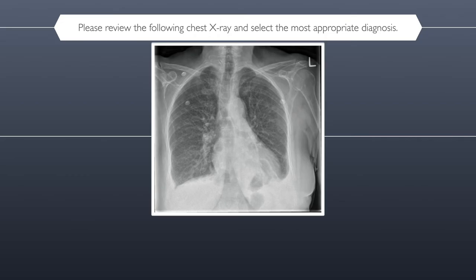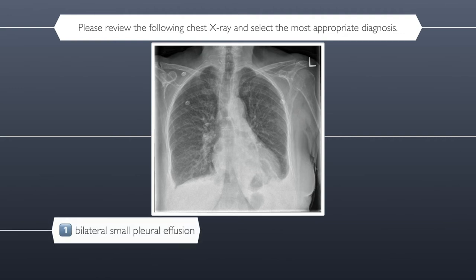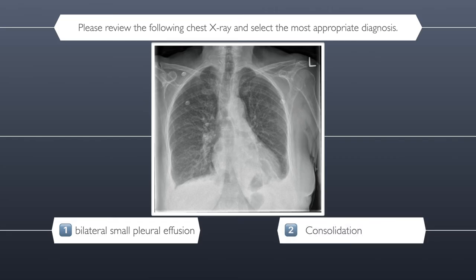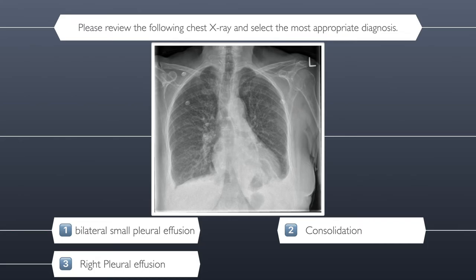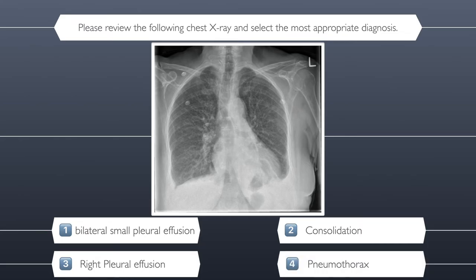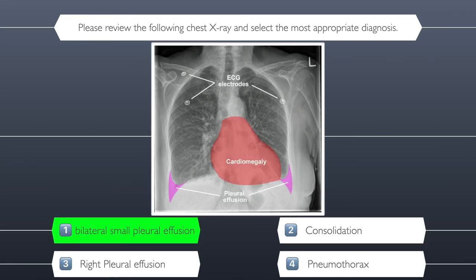Question six. Please review the following chest x-ray and select the most appropriate diagnosis. Here are your four possible answers: is it number one bilateral small pleural effusions, number two consolidation, number three right pleural effusion, or number four pneumothorax? I have the feeling that I could be sat in the presence of a medical legend. Have you selected your final answer? The correct answer is number one bilateral small pleural effusions.